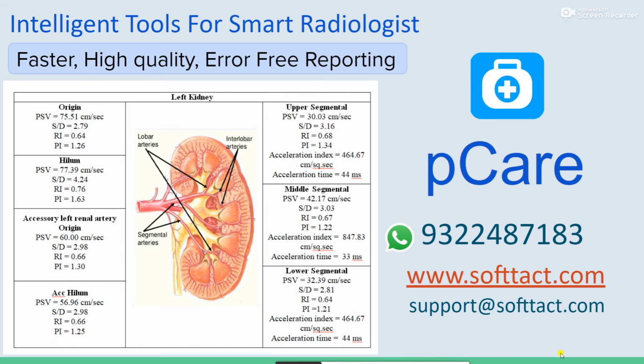Okay, now next, similarly even if you are doing upper limb arterial, lower limb arterial, or a carotid Doppler or a renal Doppler, for example this is a case of renal Doppler. So if you are measuring the Doppler measurements at origin, hilum, accessory origin, accessory hilum, and upper, middle and lower segmental, then it can read those automatically and show a nice report like this for each kidney separately. Apart from this, it can bring the measurement of peak aorta velocity also, and other dimensions of the kidneys, pre-void, post-void in the renal Doppler.